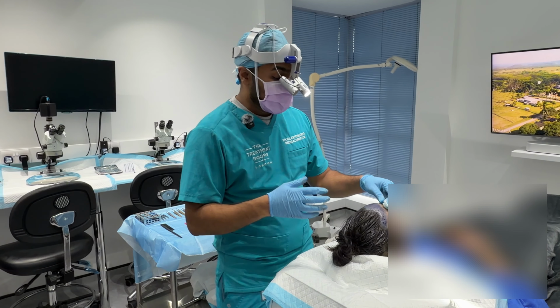So we're at the incision phase. We're just coming to the end of that. And if you come in close, David, you can actually see the large majority of the incisions being made. If I use this swab to demonstrate the direction and the angle, this here is the angle of the hair in this corner here. As it comes into the sideburn, it's very shallow and down towards the ears to keep that natural and flowing. And then here you can see the angle just slightly changes. And this is the patient's natural hair direction.